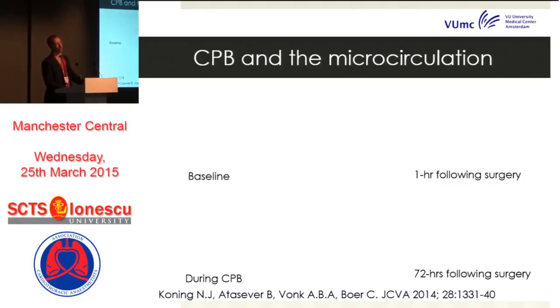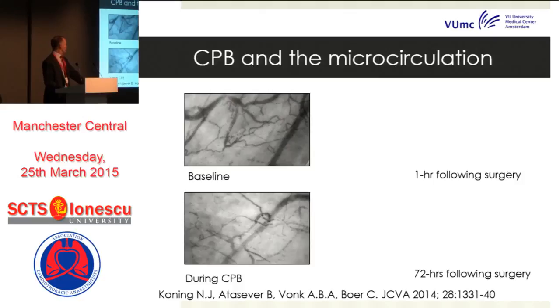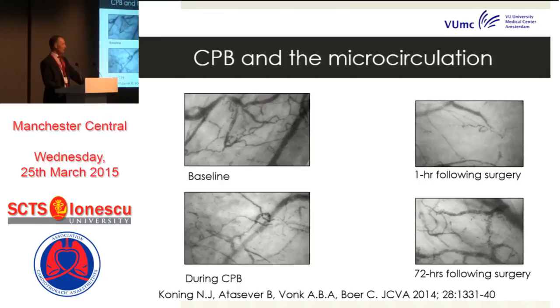I'm very grateful to Dr. Chris de Boer and Nick Koning from the VUMC in Amsterdam, who gave me the next couple of slides. They use side stream dark field imaging to look at the microcirculation under the tongue. What they show, this is a baseline of the microcirculation, but within 10 minutes of going on bypass, there is a marked decrease in perfused capillary density. This is even worse by the time you finish bypass and 1 hour later, and they report that it isn't back to normal until about 72 hours after bypass.